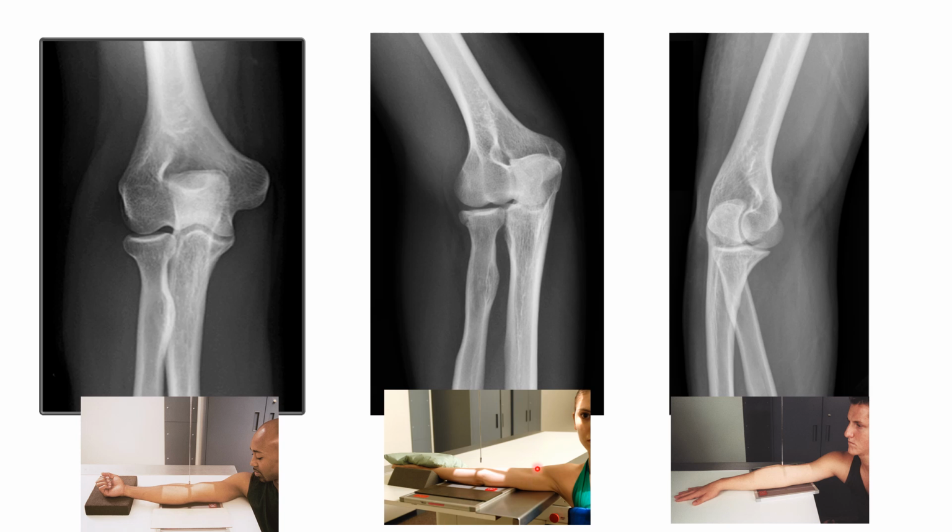Now another thing that we will be assessing in our laterally or externally oblique elbow x-ray is that when we rotate the arm laterally, if we look at the picture of the lady in position here, we can see that she's rotated her arm externally, laterally, away from her body. Her thumb is pointing down towards the table, and in doing so, she's taken the lateral side of her arm and put it on the IR. The medial side of her arm is rotating up away from the IR.